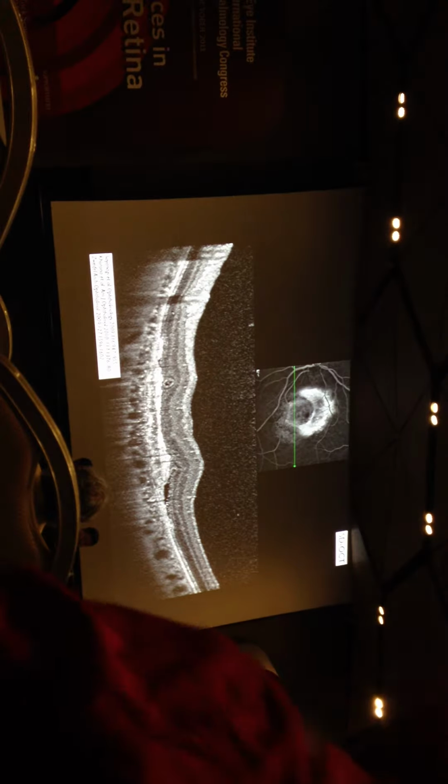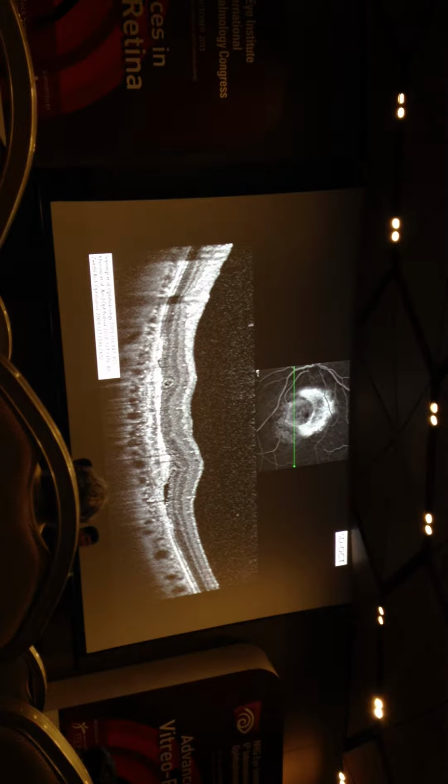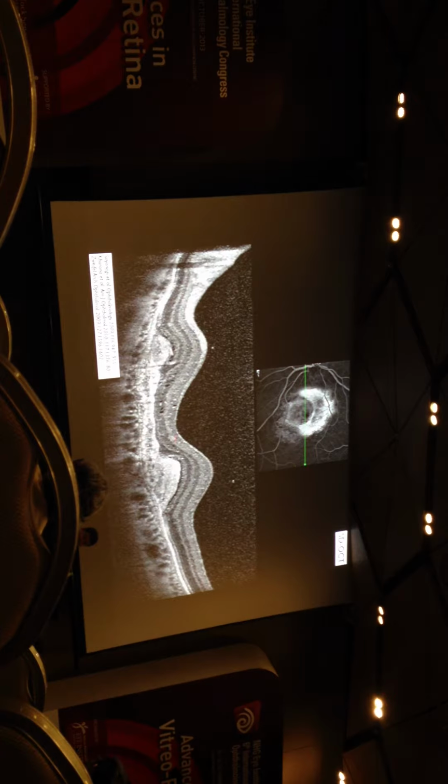But there are other signs, as we said yesterday, for recognizing the activity or the non-activity of a lesion. For example, here there is outer retinal tubulation, which you will not consider. Probably here it should be considered like a fluid, but if you look carefully here, it seems that an outer retinal tubulation is forming in that way. Then you have fluid over here, cysts over here, and these are considered signs of activity.